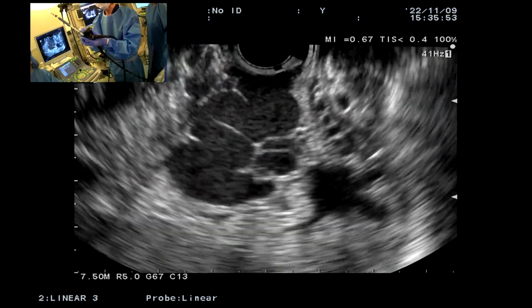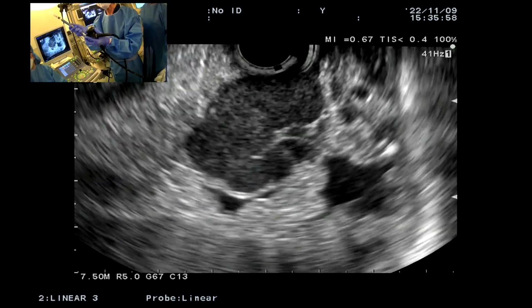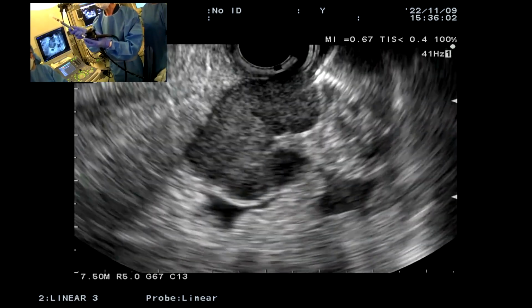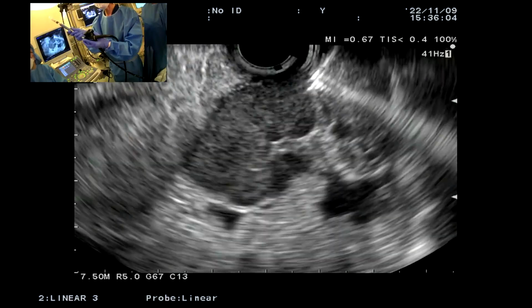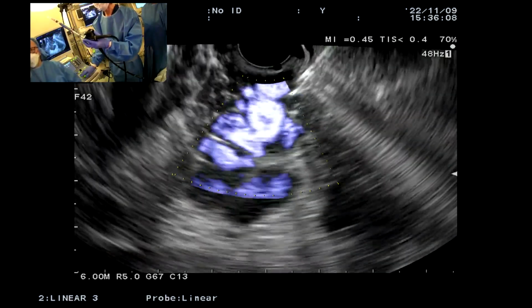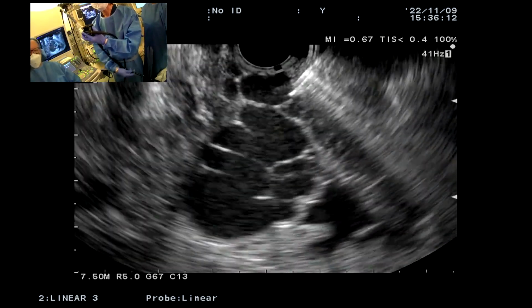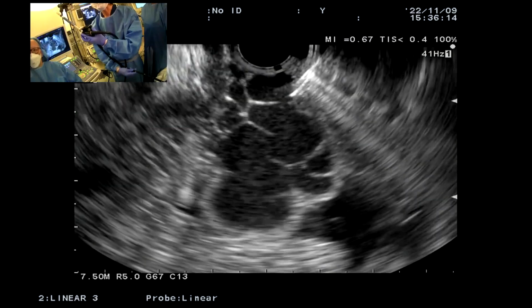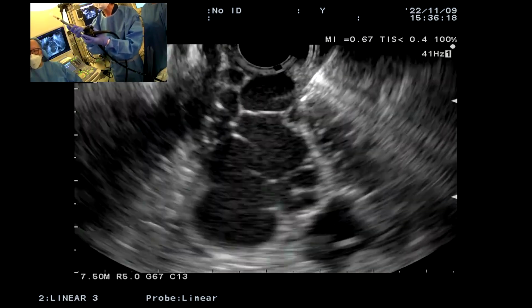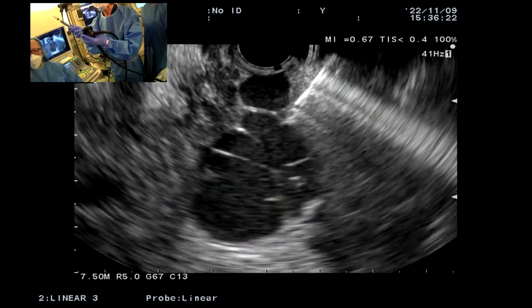We're definitely outside of the elevator. So there's our varix, very nicely seen. It's actually a beautiful position right here. I think we're ready to puncture this. Okay, and we've got very nice Doppler flow there, as you can see. So we're ready to puncture. Let's rotate this just a little bit. So you can see it's one varix, but it's all coiled up.